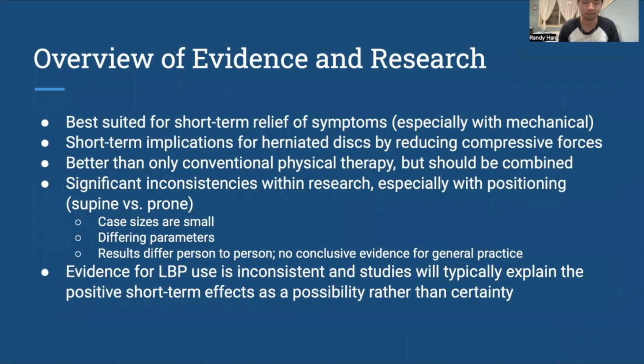Think about that donut with the jelly: the more pressure you have, the more jelly is going to come out. So if you take out some of that compressive pressure, that should help alleviate symptoms. It is better than only conventional physical therapy, but when you combine lumbar traction with physical therapy, that's usually when you get better results.